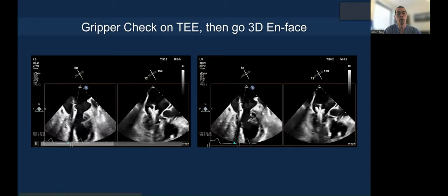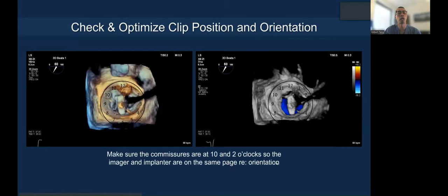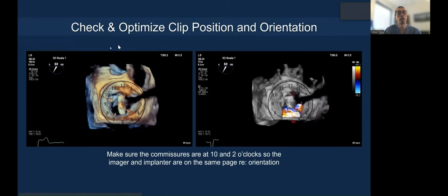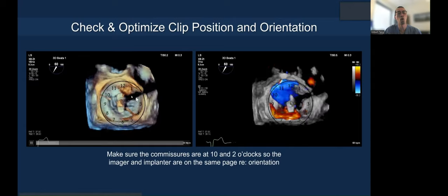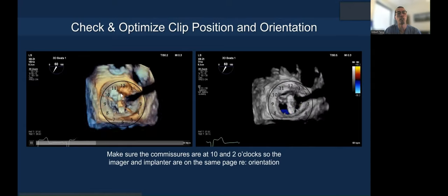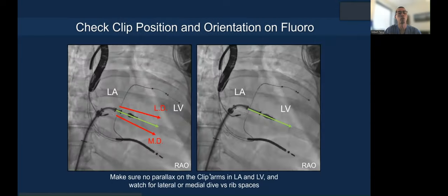You perform your gripper check on the bicommissural X-plane view — this is the posterior gripper, this is the anterior gripper — you can do that on echo. Then immediately go to the 3D en-face, where you can see the commissures at 10 and 2 o'clock to standardize reference points. You can see the clip is at 12–6 orientation right above the jet — good to go, ready to enter the ventricle.